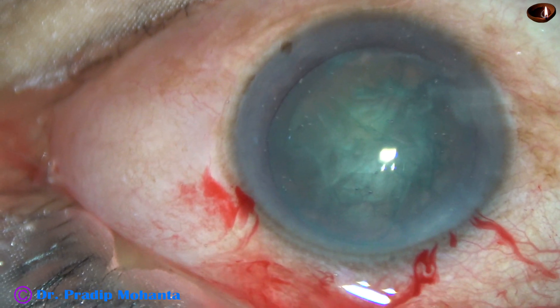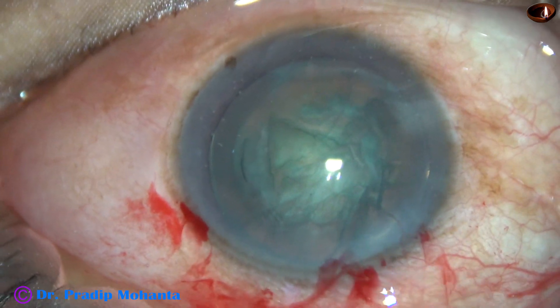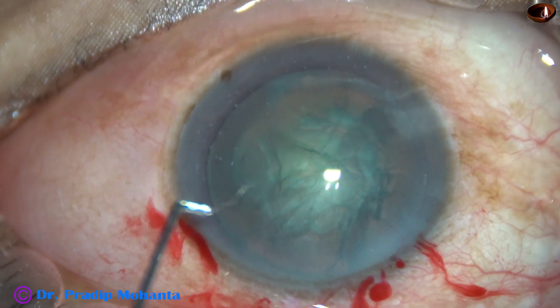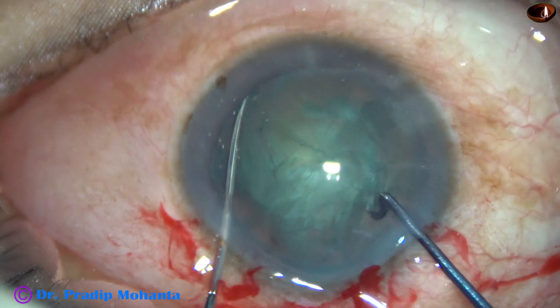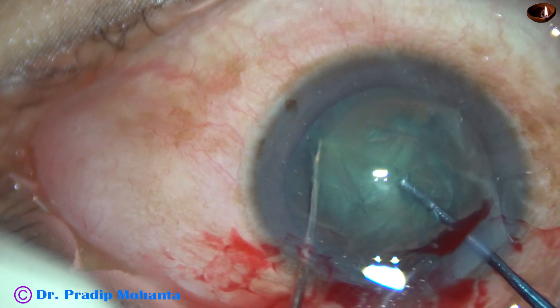After incisions, rhexis, and hydro-dissection, visco is injected into the anterior chamber. Now the pre-chopper goes in the right hand and a sustainer in the left hand. The sustainer, in this case, is just a blunt chopper.